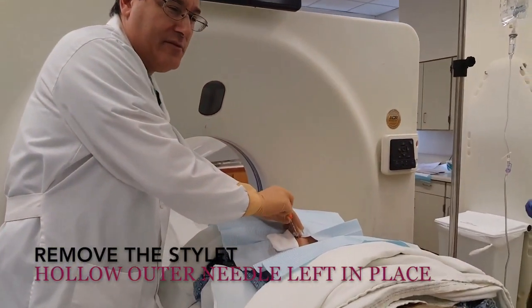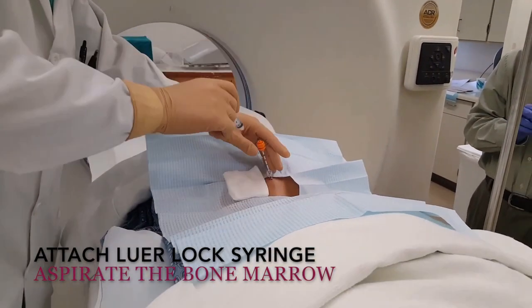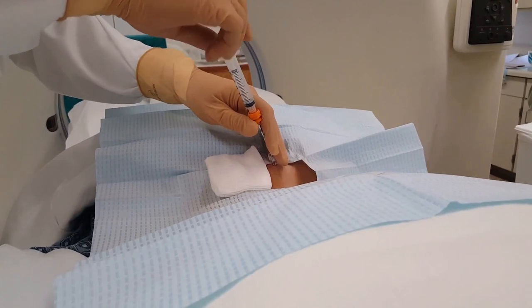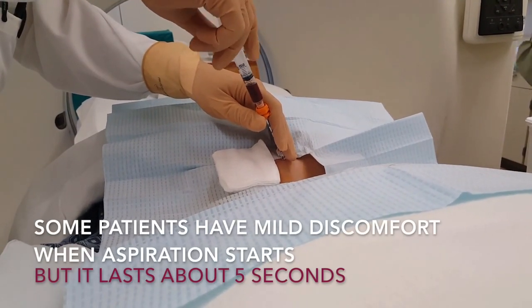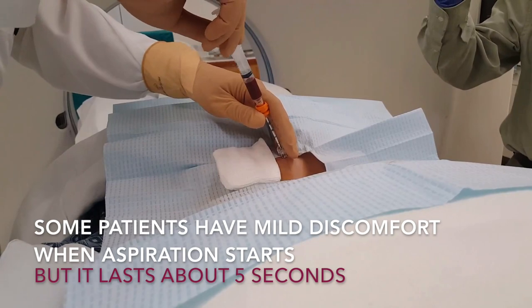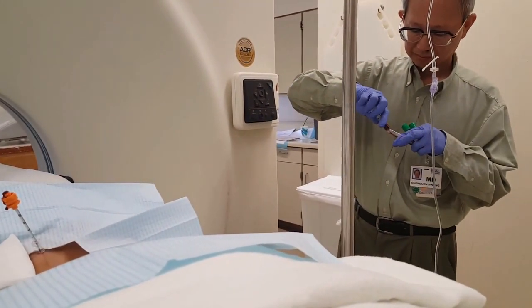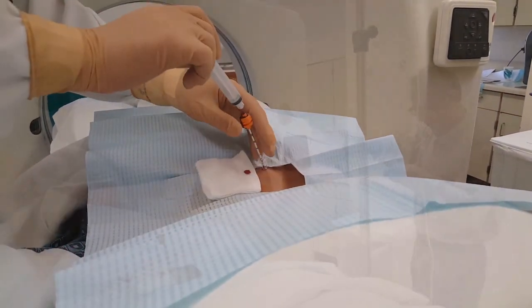I'm going to get the small syringe first. If I pull back quickly, they get a lot of particles — so that's what we're going to do here. It might not be in far enough, but let's give it a try. I can feel something there. So we've got about 2 ml. Now we'll get the rest for a total of about 10 ml.